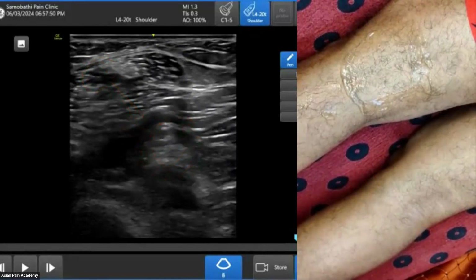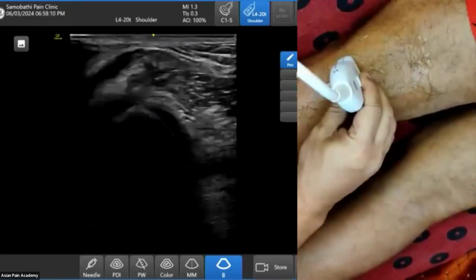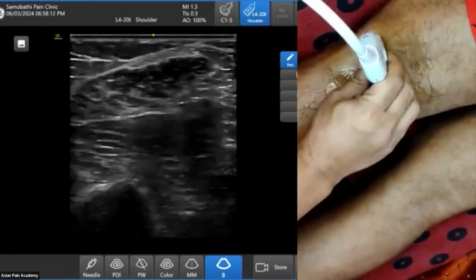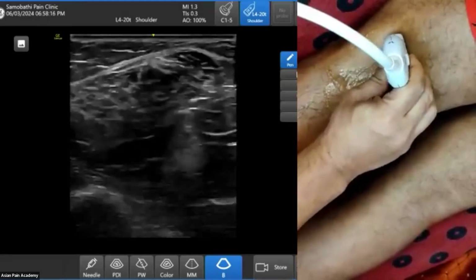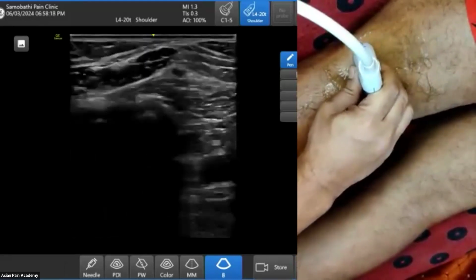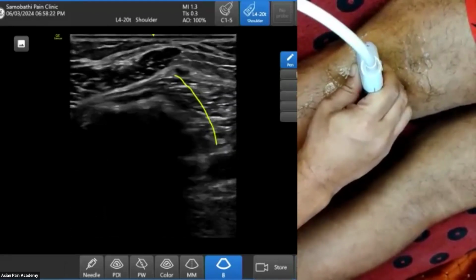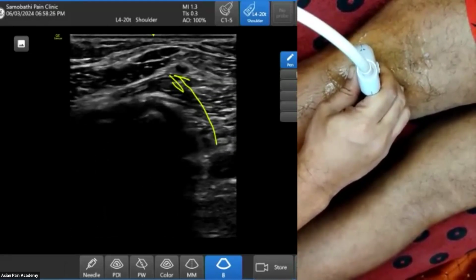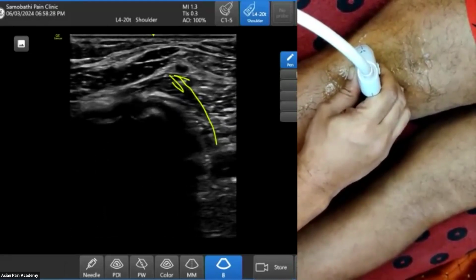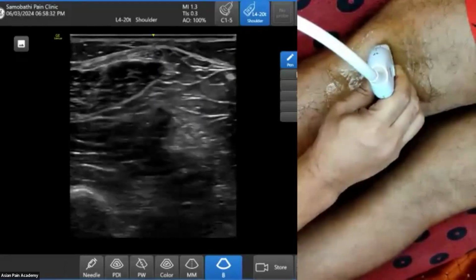So see again. Again the biceps femoris. I am going just up and down, and suddenly I see something coming to the biceps femoris margin. As I have already seen the biceps femoris, I will go a bit up to find where it joins with another nerve.